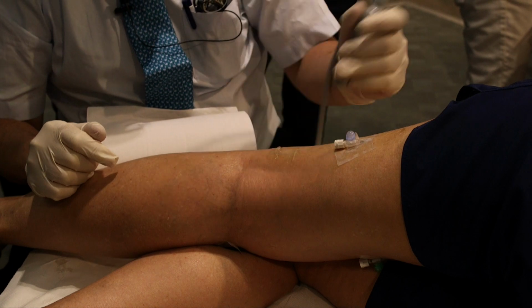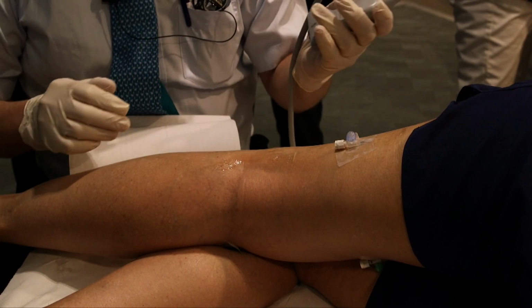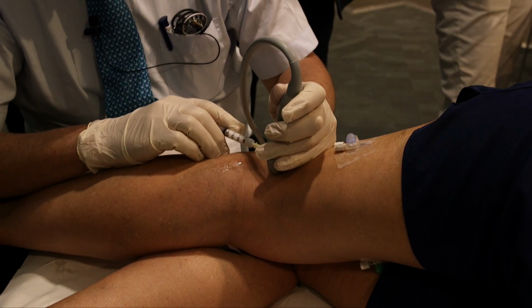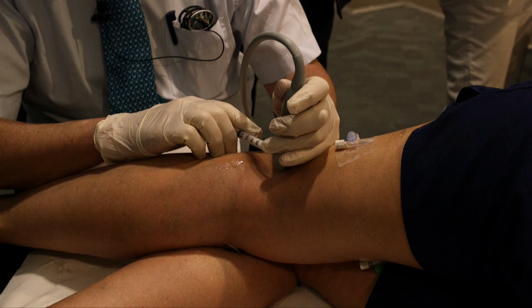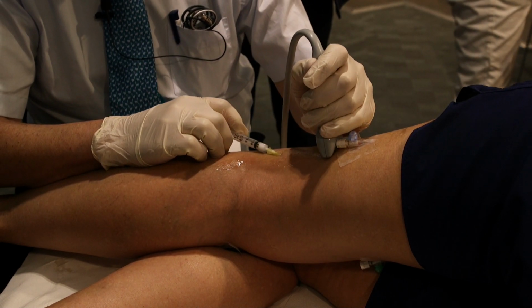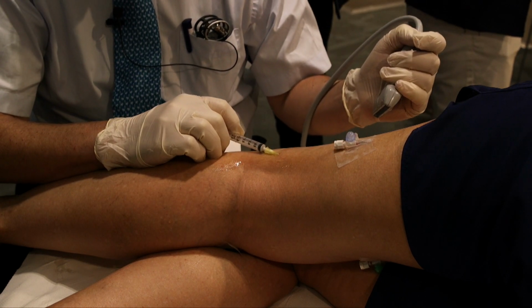So the varicose veins you can just about see come down here and around here, and some go over here as well. So we'll do two or three injections in the back here. A little injection in here then. Okay, so there's the foam drifting along the vein. We can see it on the ultrasound image, but we can also see that the vein is becoming paler by the moment. So it looks better already. Okay, same again.